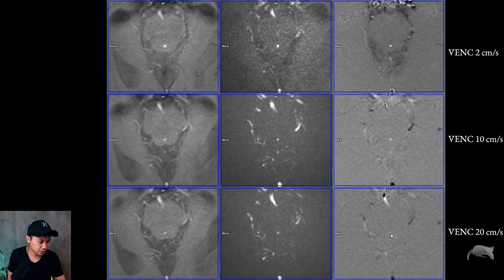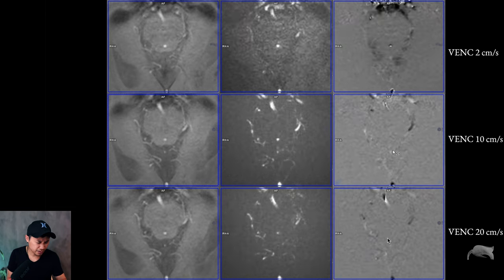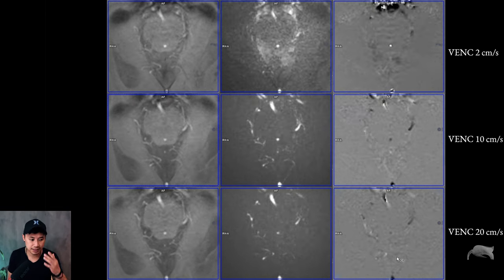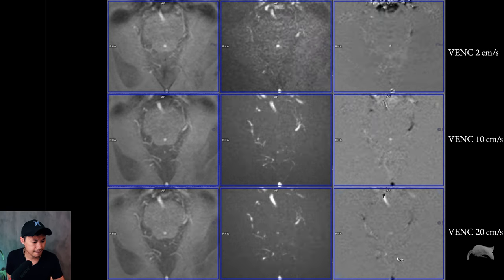There you have perfect. Bright and dark is perfect. And the low one is very soft. So being at the rank 10 seems to be more correct in this specific case.